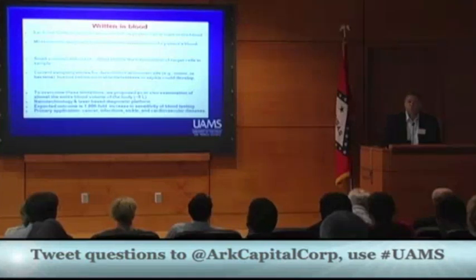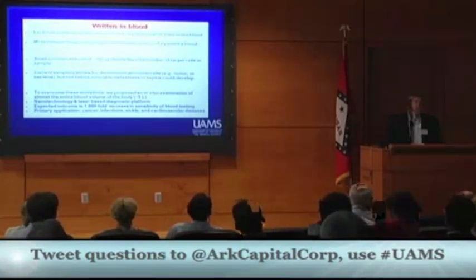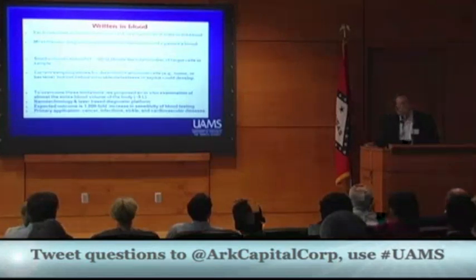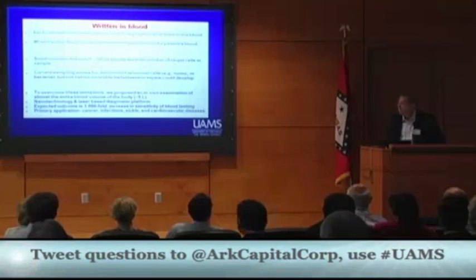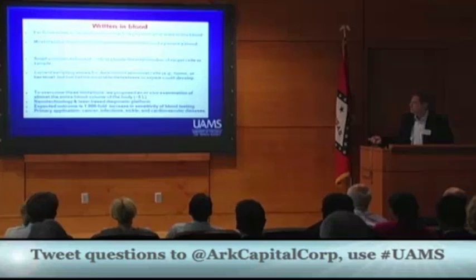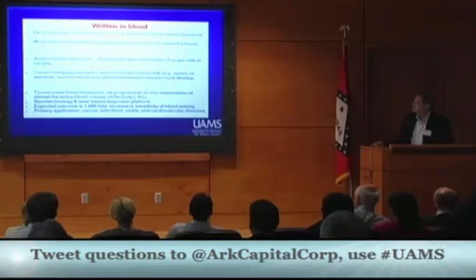So what does it mean if you miss 5,000? It's too late to treat cancer, because metastasis has already developed. It's too late to treat sepsis because it has already developed, and so on. That's why, as a principle, this is new: early, super sensitive diagnosis, with great potential, but we are at the very beginning. The potential impact is a 1,000-fold increase in sensitivity compared to the conventional blood test.